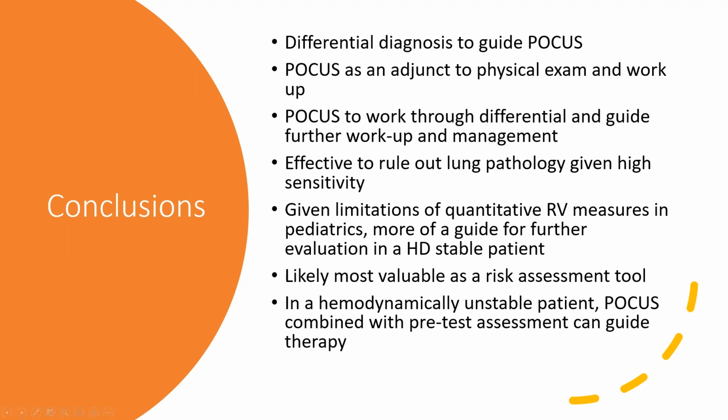Lung ultrasound is very sensitive. And so in this patient with a negative lung exam, that can effectively rule out significant pulmonary parenchymal pathology. Now, you may see a pleural-based lesion, a hypoechoic pleural-based lesion that may look a little bit like a subpleural consolidation in a patient with a pulmonary embolus that could be indicative of a pulmonary infarct. But the most likely lung ultrasound finding in a patient with a pulmonary embolus is nothing.